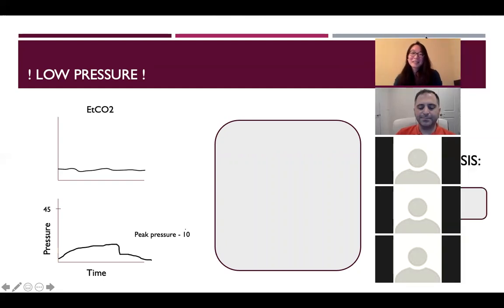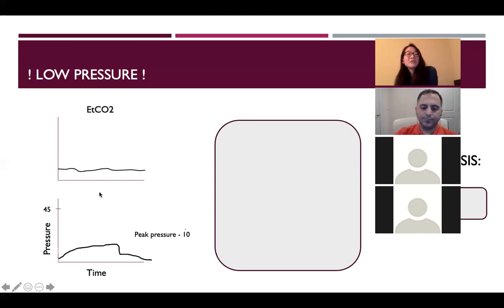It looks like it's messed up. Yeah, okay. Let's look at the, go ahead. I mean, I actually don't entirely know. Is there too much of a difference between the, I don't know, is this like a kinked tube kind of scenario? I'm not really sure. Not quite. The kinked tube scenario that you're thinking of would be like this and then down like that, showing a ton of airway resistance. I'm showing a normal airway resistance here. But you're right in that both of them are abnormal.